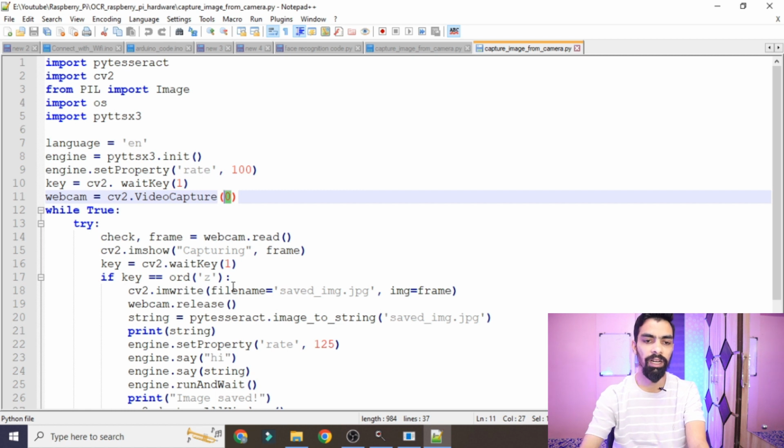If you are using the Raspberry Pi camera, then you can use 1 or -1 here based upon your input for the camera. Basically I am using a USB camera, that's why my input is 0. So the webcam input is connected with port 0. This is the line which is used to configure the webcam input.